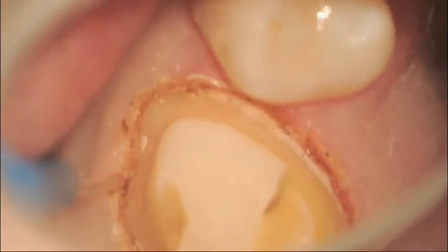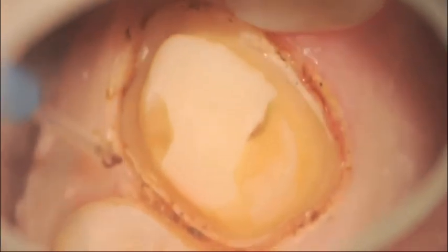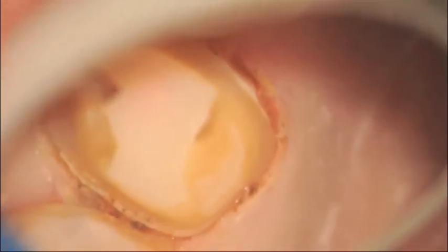The troughing took about 3 minutes. You can see there's no bleeding. The tissue appears healthy in color, and we're getting close to a point where we can take an impression. If you feel that lateral distension is needed, you can use materials like Expasyl or Traxodent to accomplish this task.